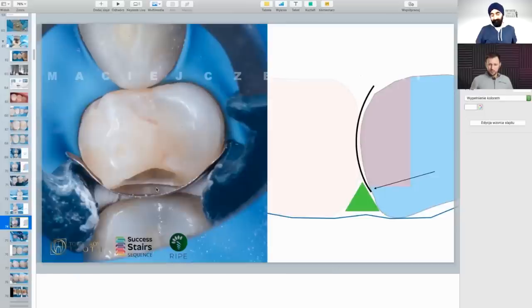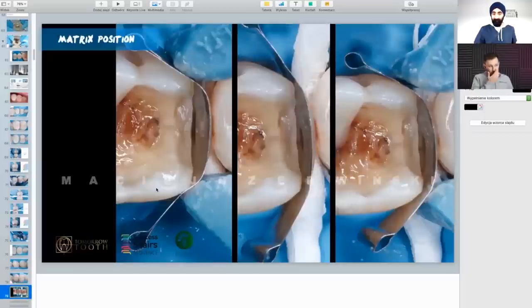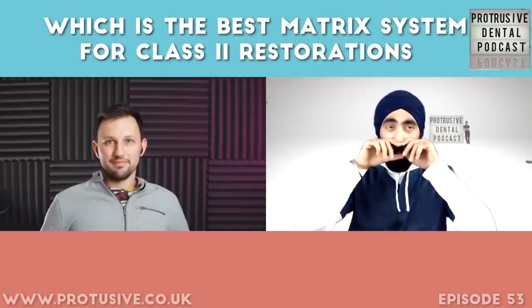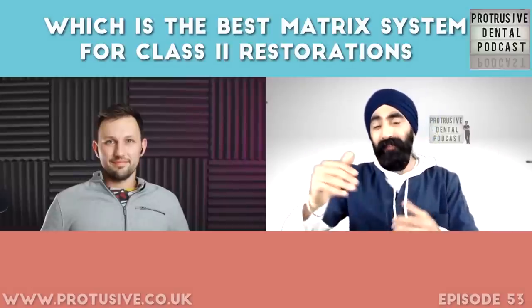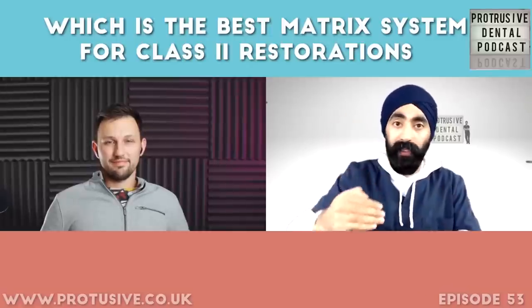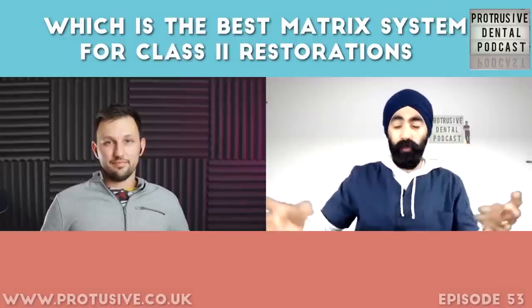It's so simple — just move the matrix up a little coronally — and there's no problem. Nobody told me this for many years. I was trying to push more teflon, trying bigger wedges, pushing harder — no positive effect. But just moving the matrix up solves so many problems. Another advantage of the teflon floss technique here: you don't have to remove the wedge to reposition the matrix — you take the matrix out and replace it in a better position. From the little gap there is suddenly no gap at all. It's so easy, but nobody tells you.